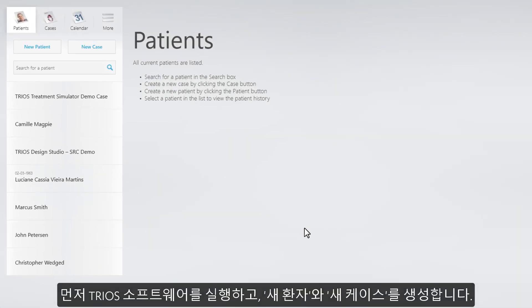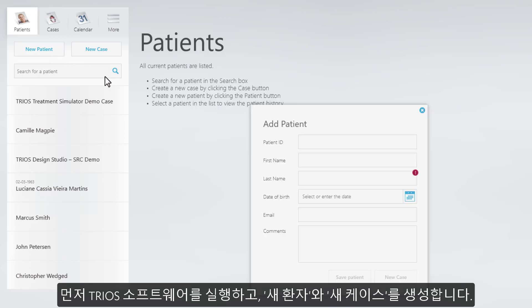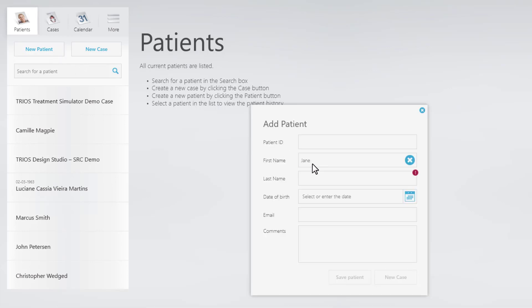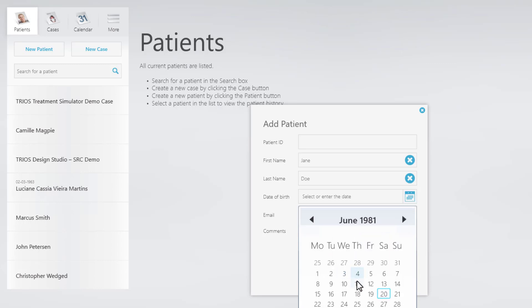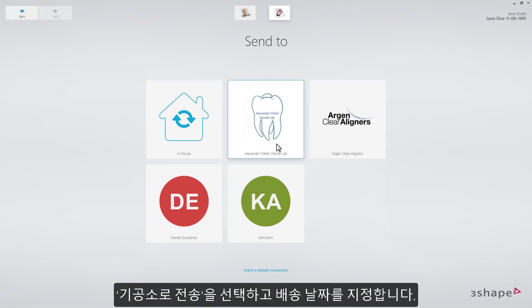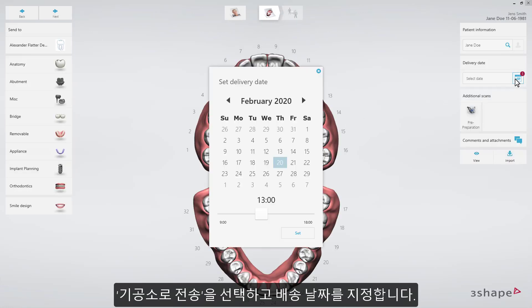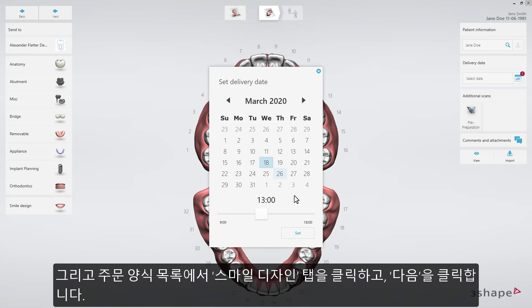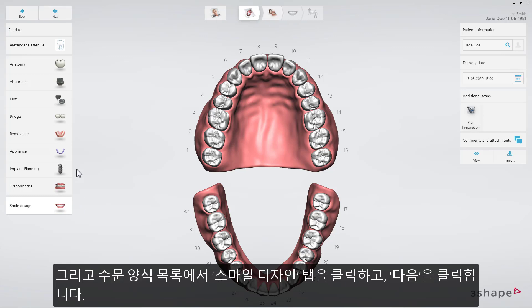Start by opening your TRIOS software and create a new patient and a new case. Choose Send to a Lab and specify a delivery date. Then, when in the order form, press the Smile Design tab in the Indications list and press Next to go to the step where you'll import photos.